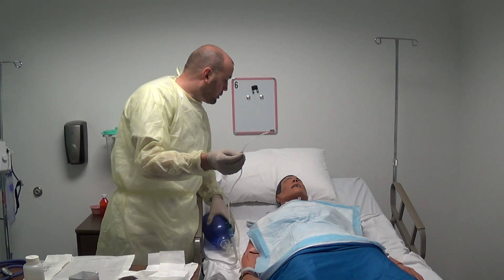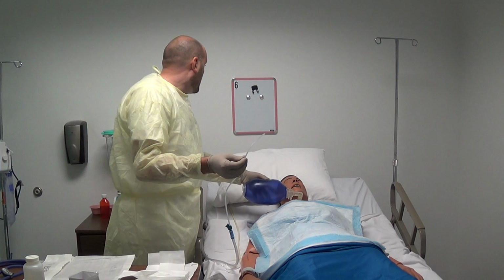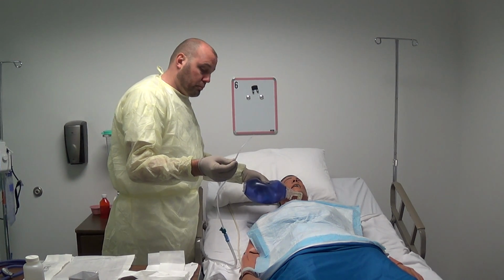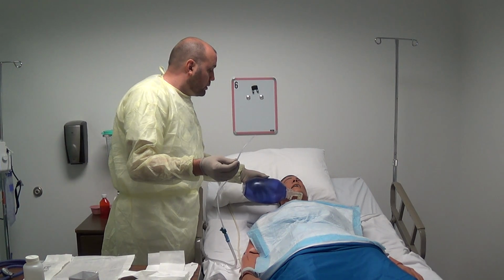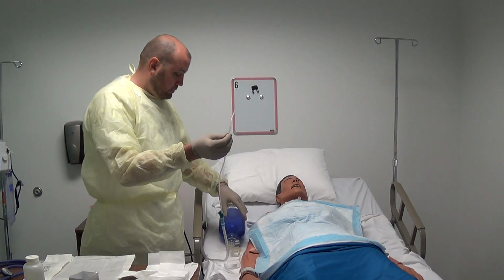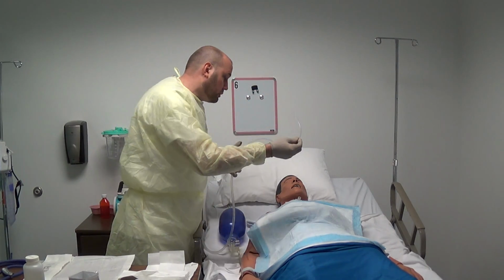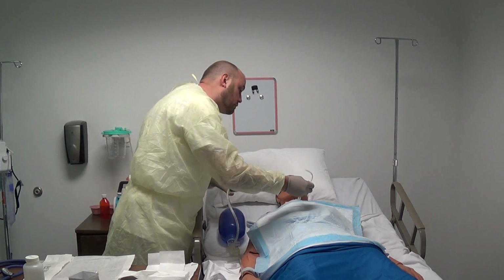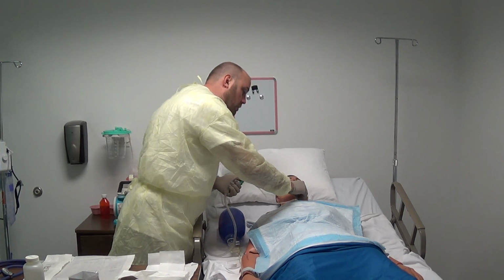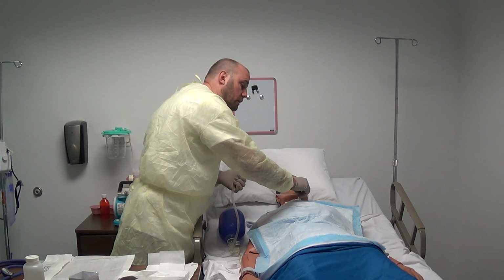Mr. Smythe, you're doing okay? Nods. I can provide Ambu respirations. There's still some secretions here, so we're going to advance the suction again till we meet resistance. Drawing it slowly, 1 centimeter at a time, providing a light suction.